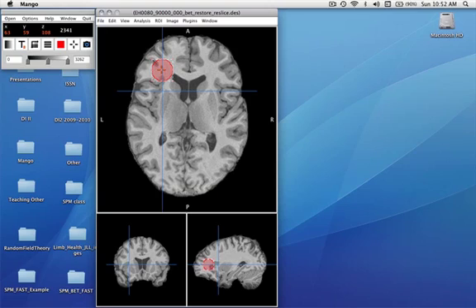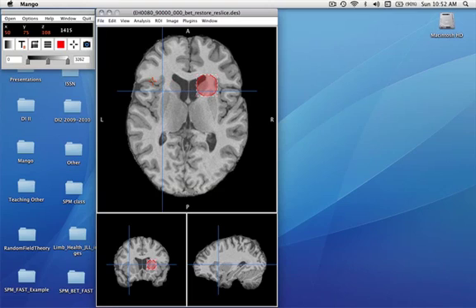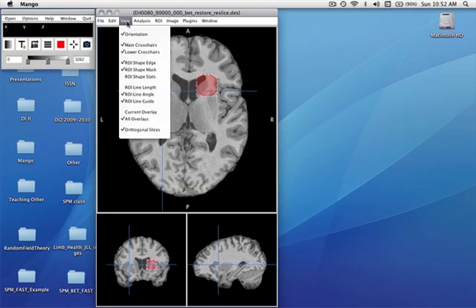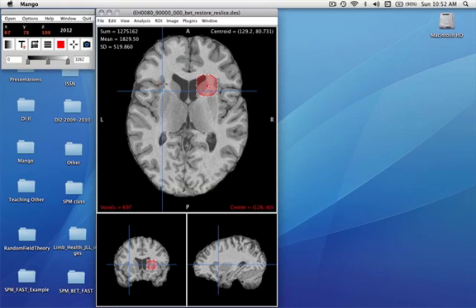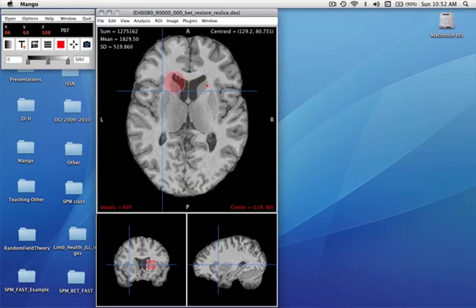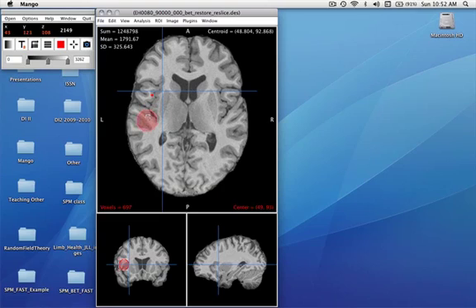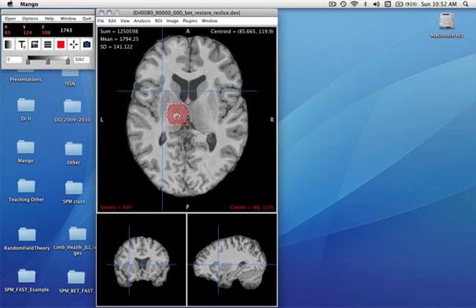You can move the region of interest around in 3D, but more importantly, we can get statistics about the region of interest of varying shapes. This is a small-shaped region of interest, and as we move it around, we can measure average values, standard deviations, centroid locations, etc.